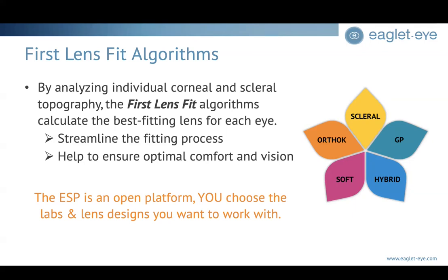So if I'm fitting a scleral lens, I'm going to select scleral first lens fit, and then from there, there's an option to select whatever manufacturer you want to work with that's within the software.